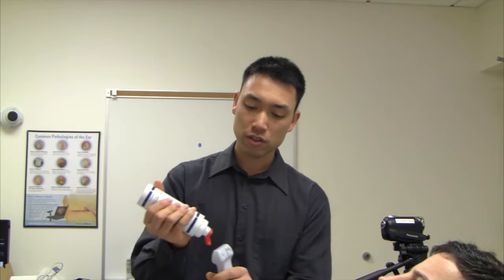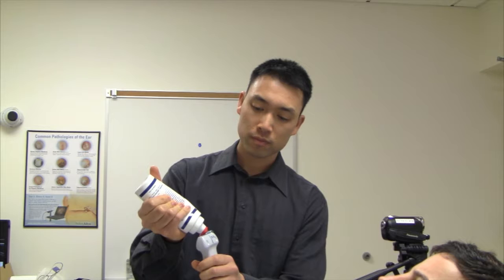What we're going to do is use the linear probe, and I'm going to take a decent amount of gel and put it on the probe. The structures we're going to identify on this exam are: the thyroid, which will be really easy to see; the trachea; the cricoid cartilage; the thyroid cartilage; and then we'll recap the carotid artery as well as the internal jugular vein.